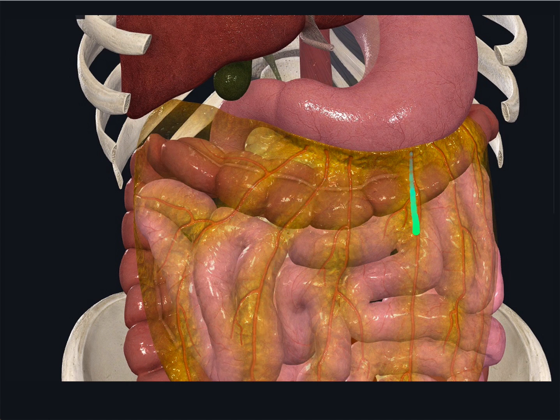It's a good tissue to demonstrate the histological structure of small arterioles and venules, which we saw in previous lectures, and also blood capillaries.